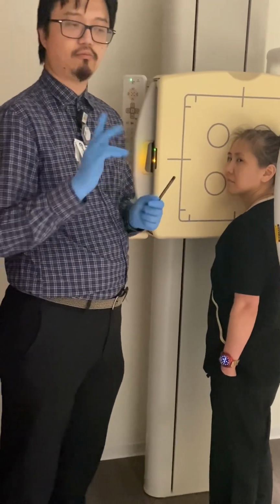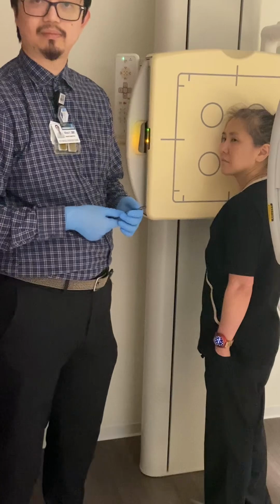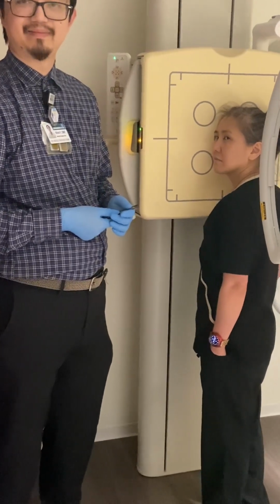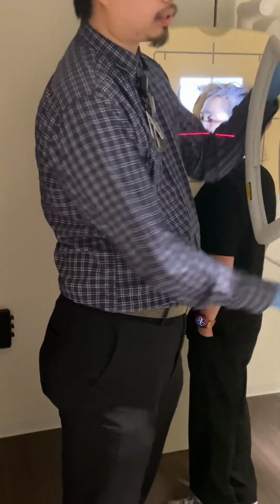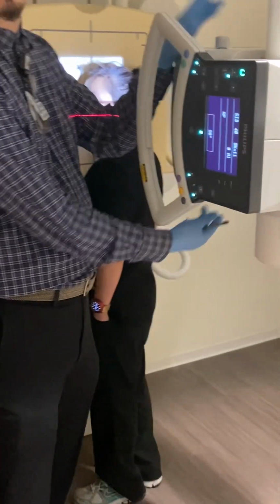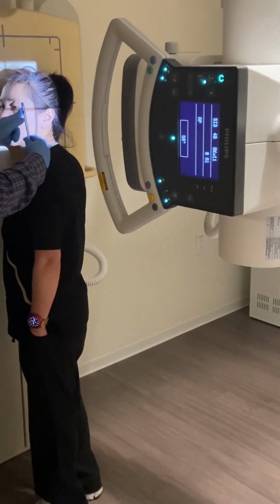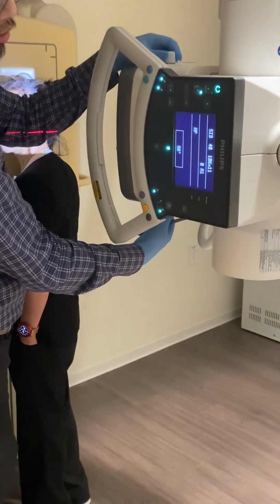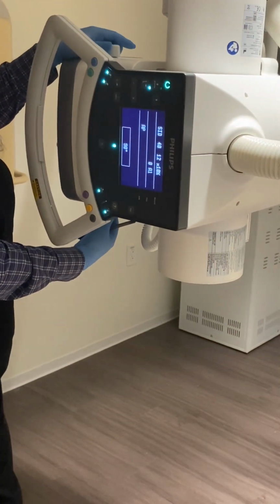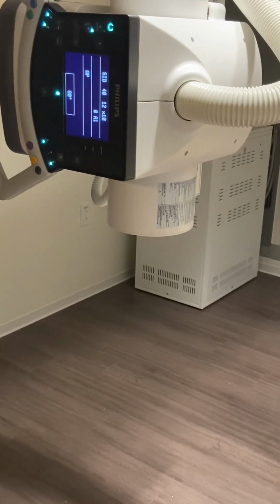Actually, first of all, which lateral are we doing? Skull, facial bones, or sinuses? Skull. Skull, okay. So for the skull, we are going to need to change our collimation. Because if you look at the head is longer than it is tall. So we need to switch this to a 12 by 10. Okay, that's good for it.